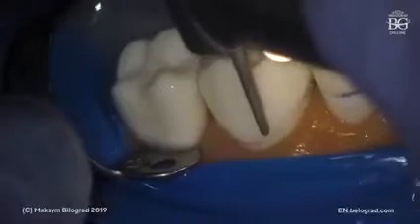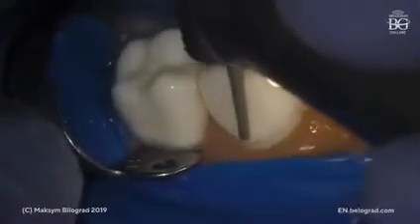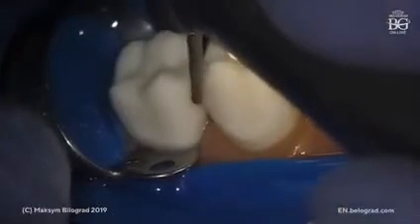And now, finally, we will move to the cervical plane. I will make an initial finish line really slightly visible, just a scratch. The angle that I'm holding my burr is the same as the cervical plane. Now take a look at what I'm doing. I'm moving my burr from the vertical axis of the tooth, making the preparation to distal.